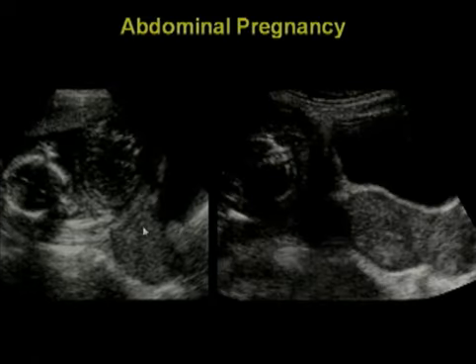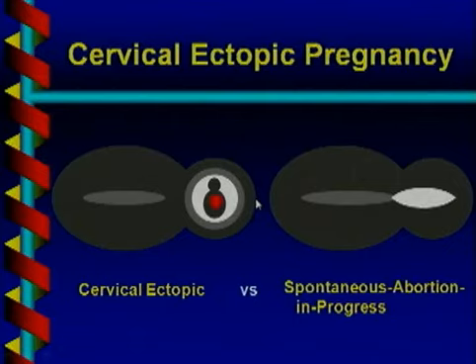But when we looked a little more carefully, you could see that this was actually the whole uterus. When we moved the transducer a little bit, there's the top or the fundus of the uterus, and this pregnancy is just sitting free in the abdomen.